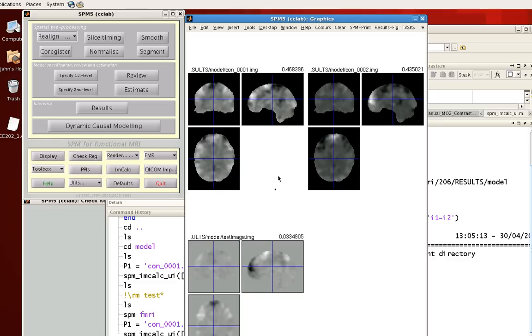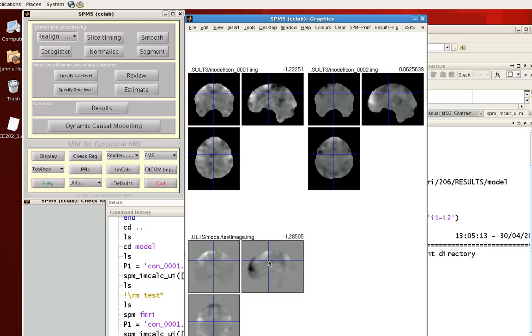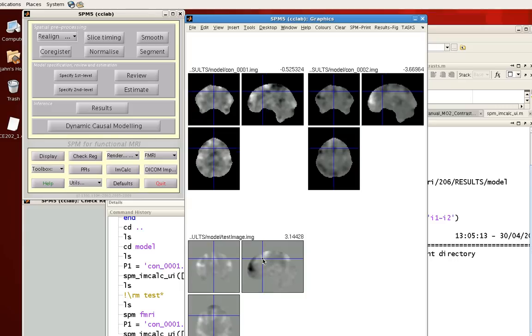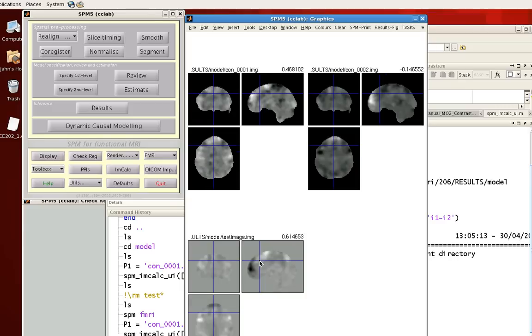So notice now if I'm centered at one voxel right here, about .46 for contrast 1, .43 for contrast 2. And the difference between them is about .03. And you can see that no matter where I click in this image over here, it should be the difference between these two top contrast images.